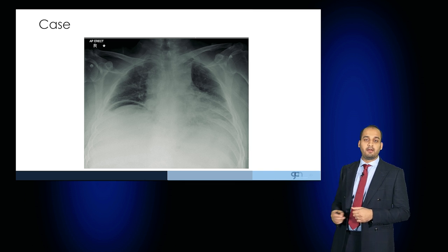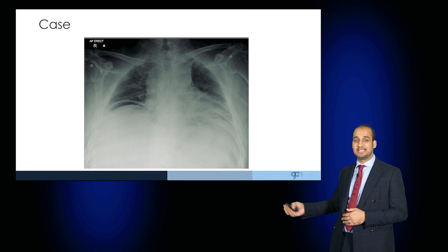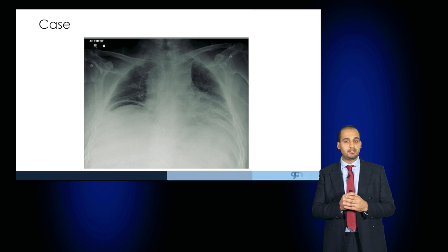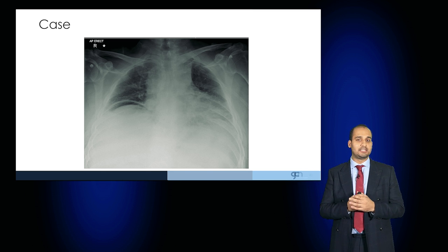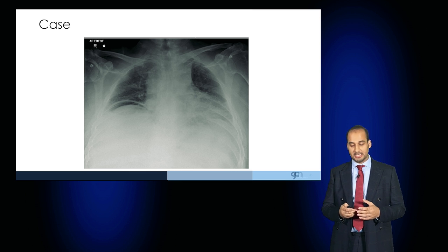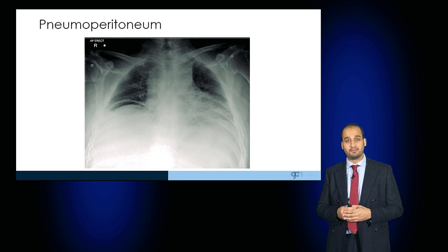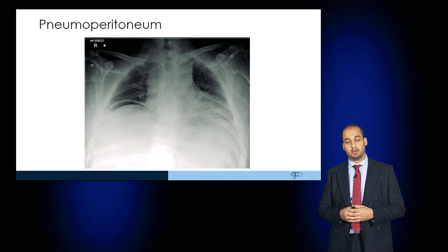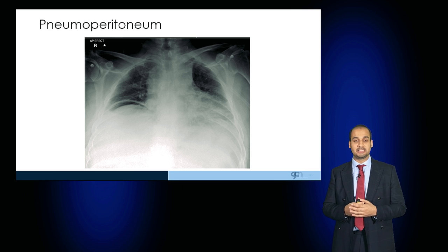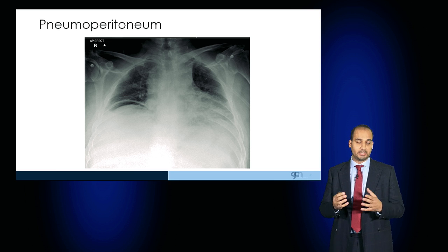This is a very important radiographic finding. If you look at the right hemidiaphragm, there is air under the diaphragm — this is a case of pneumoperitoneum. This suggests that the patient has had a perforation of a viscus leading to pneumoperitoneum. This patient would require emergency surgical management, should be made nil by mouth, a CT scan would be required to determine the cause, and they would be taken to theatre.